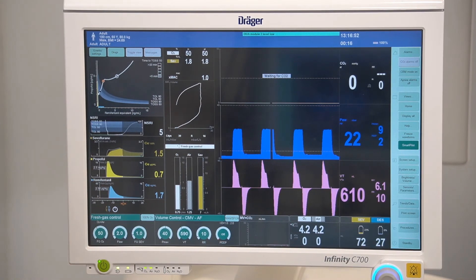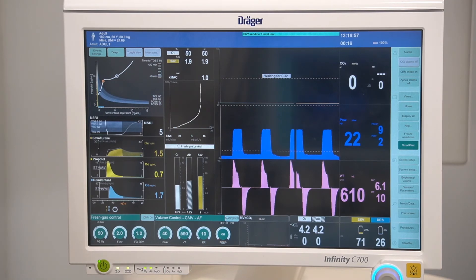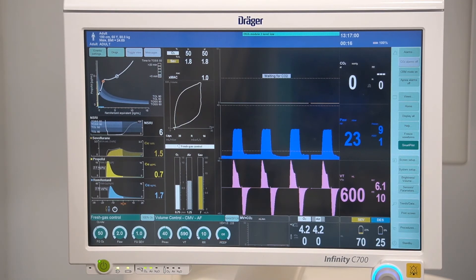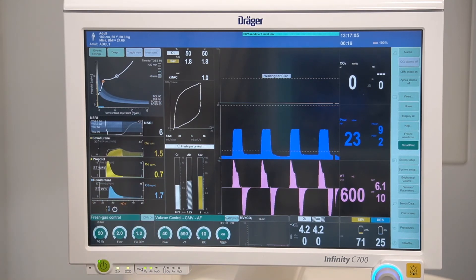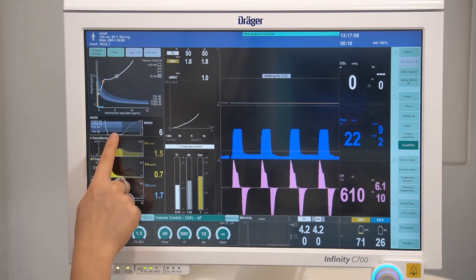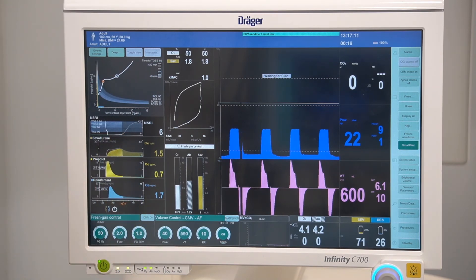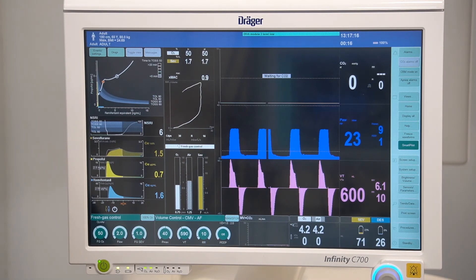NSRI stands for Noxious Stimulus Response Index and represents the combined drug effect and the probability of a reaction to a certain stimulus. It is displayed as a numerical value. The lower the NSRI, the deeper the anesthesia, and the higher the probability for tolerating highly painful stimuli.